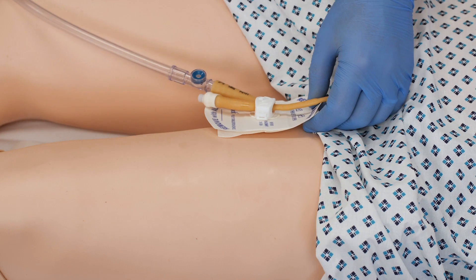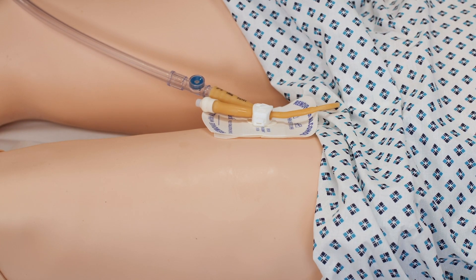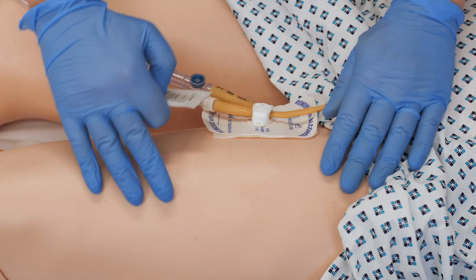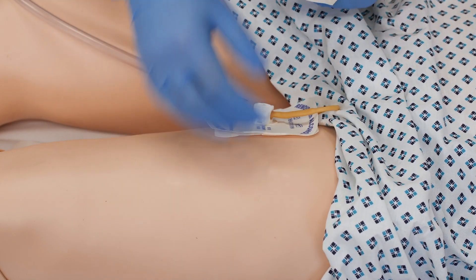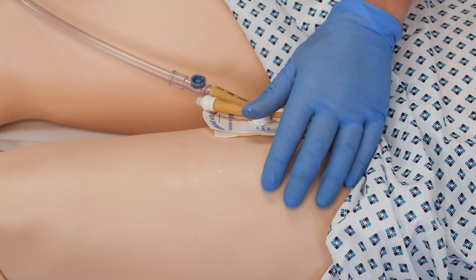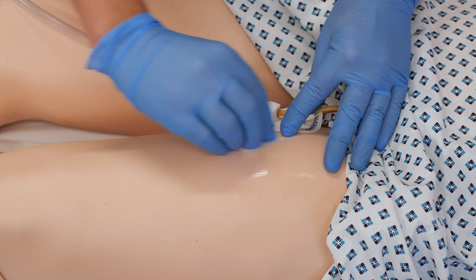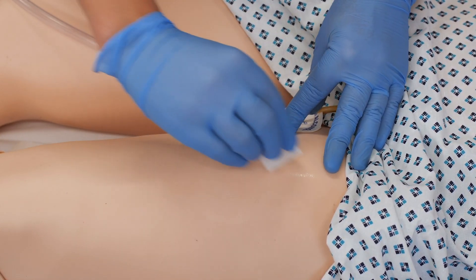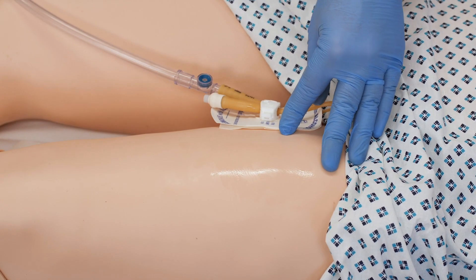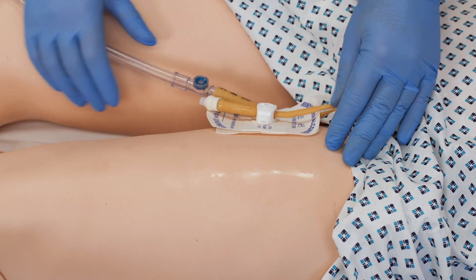Now I'm going to prepare the skin. This is a good opportunity to have a good look at the skin. If the patient has any hairs there, it might be useful just to remove those, so you get a better securement and it's kinder for the patient when removing the device.